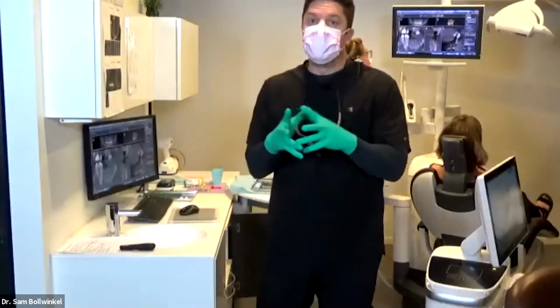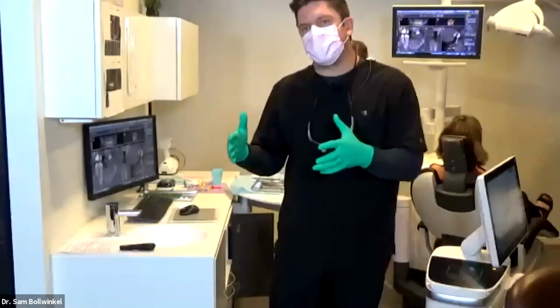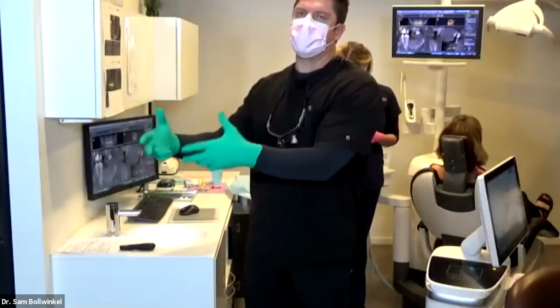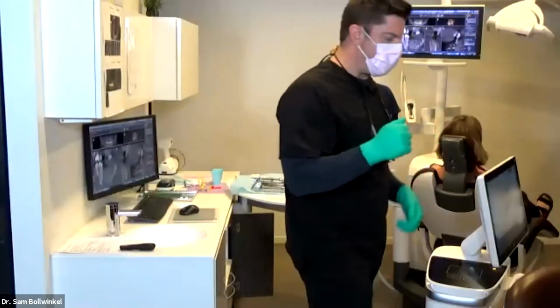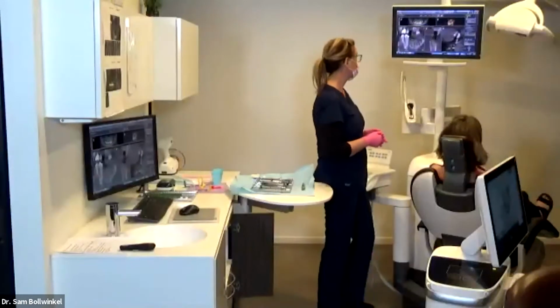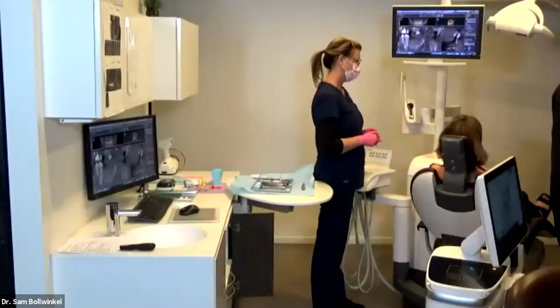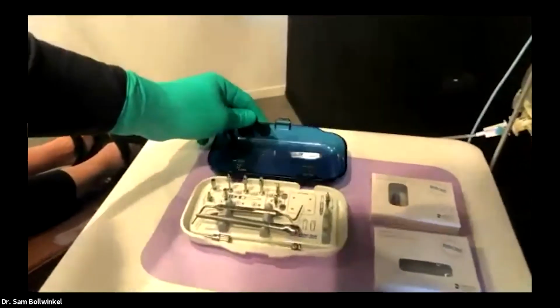I have the opportunity to bring this in and not shut down a whole day's production to go into a surgical mindset. We want to demonstrate a couple of things. We're going to switch back to our patient side right here. Go down on our technology here. One of the really cool things we want to demonstrate with Astra is the Astra implant workflow.